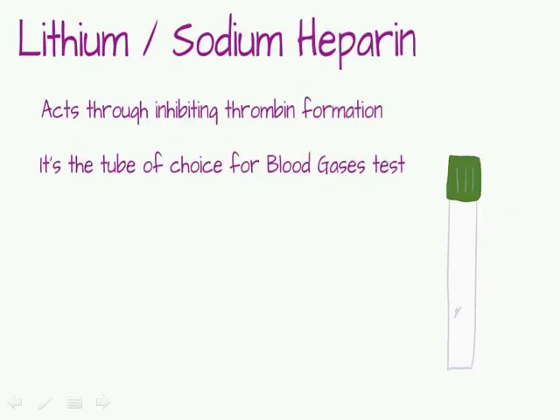Lithium sodium heparin. This anticoagulant acts by inhibiting thrombin formation, and that is done by binding to antithrombin 3, increasing its activity. This kind of tube is used in blood gas tests.